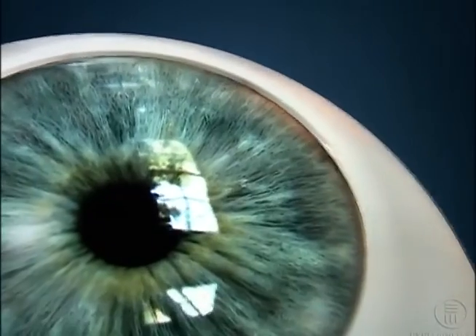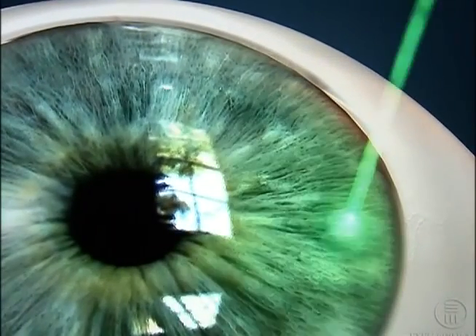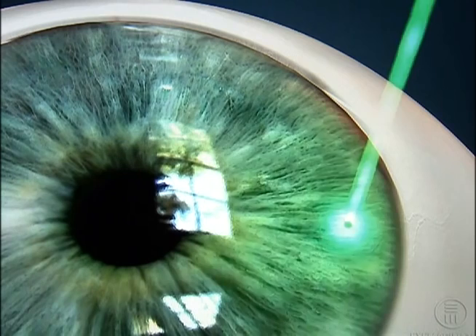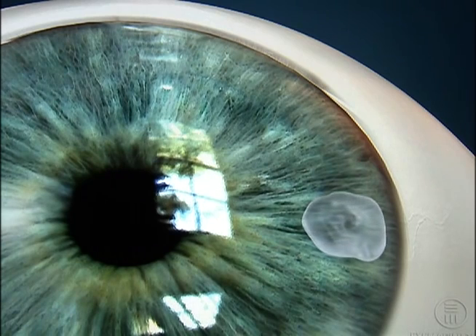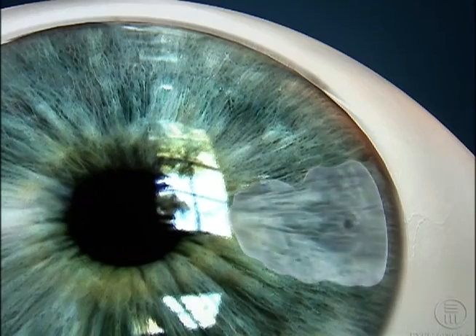Then, using a precisely focused beam of laser light, your doctor will create a tiny hole in your iris. This hole acts as an alternate channel through which fluid inside the eye can flow if the usual pathway becomes blocked.